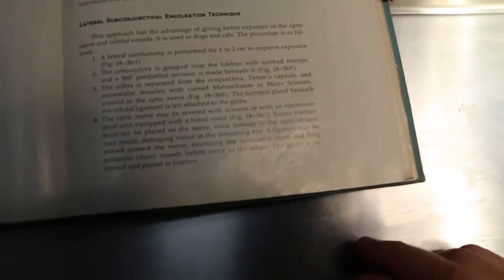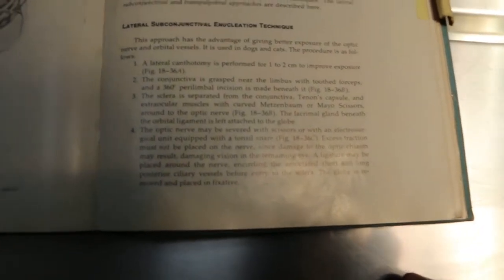So I just show the text here so that any students who want to refer to this procedure can. The procedure is called lateral subconjunctival enucleation technique. Okay, that is the name of this surgical procedure. Okay, let's see. This is the final result.